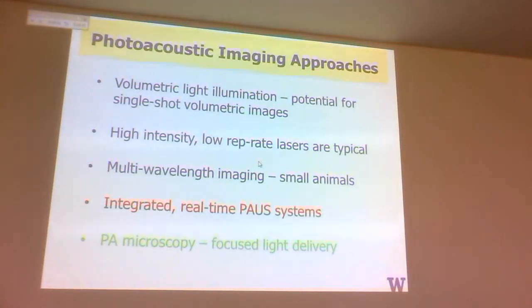Why it can be exciting is this multi-wavelength approach, which can give you some molecular sensitivity without labels. So, label-free. Where it could come into play clinically or biomedically is maybe things like flow cytometry or other things. I will talk about that a little bit at the end of this session.